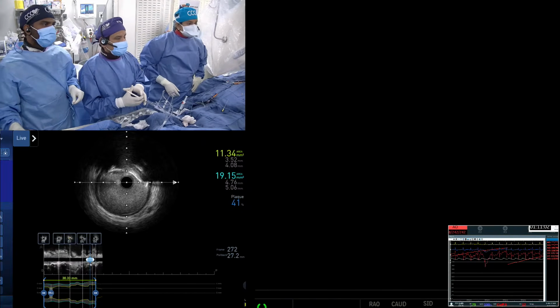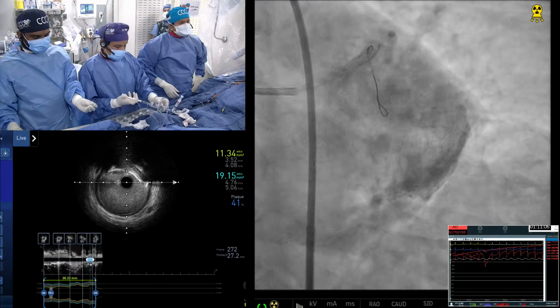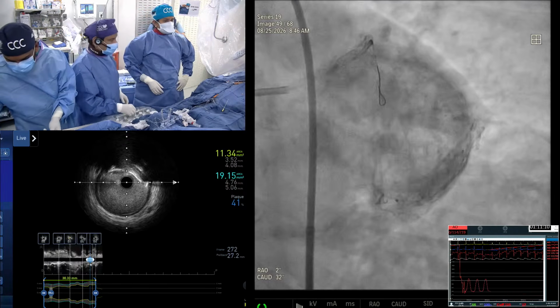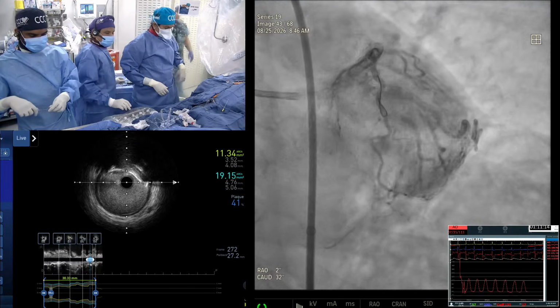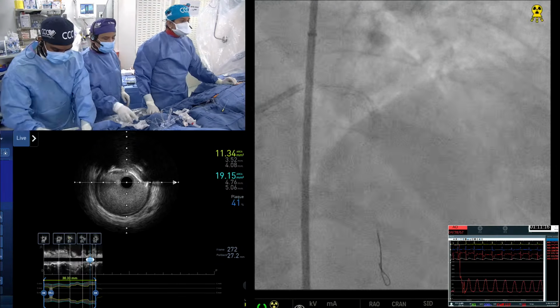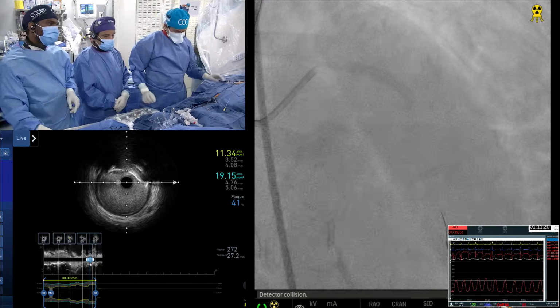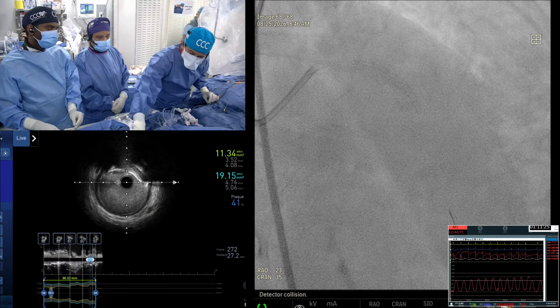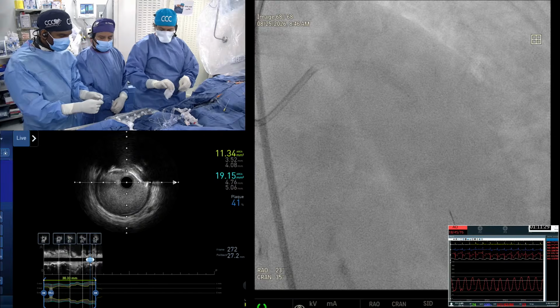Now take a picture. Make sure the circ is good. Circ is okay. It's the diag doing that. Okay, I think we'll leave it alone, no? Right, diag now. Let's see. It should come back. Let's post. Okay, give it to me. Yeah, 408.